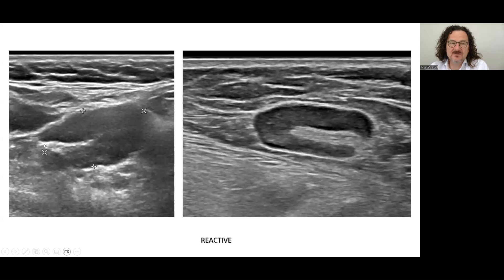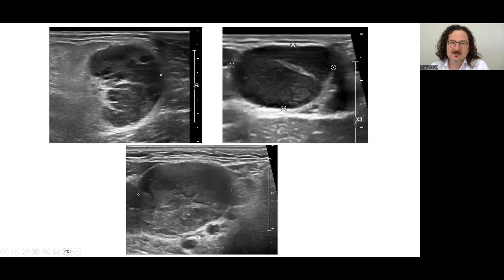These are two reactive nodes. The ecogenicity of the hilum is preserved, not distorted, not displaced. These are abnormal examples — you see the amputation of the hilum and displacement of the ecogenicity. These are two lymphoma examples. And this is a metastatic node — no ecogenicity of the hilum.